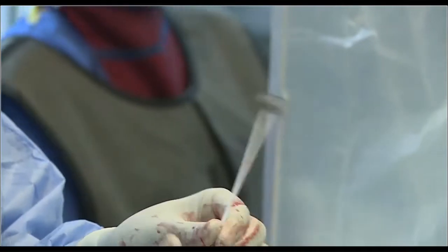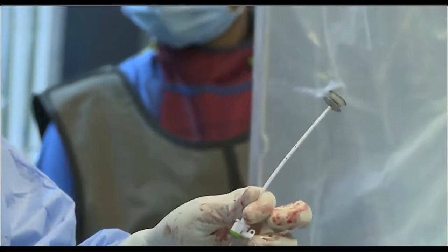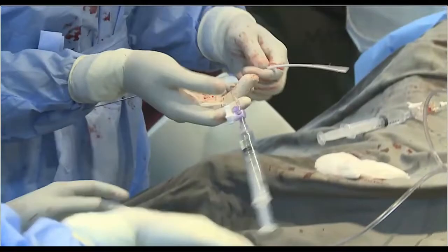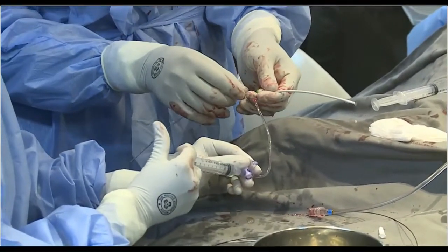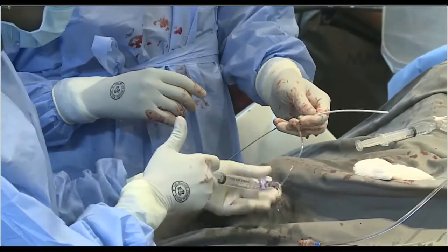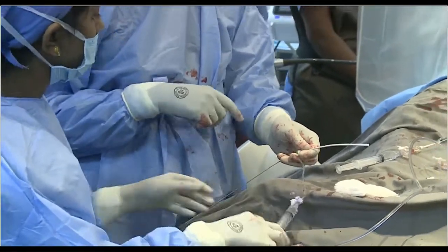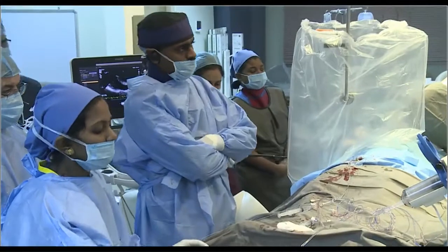It is compatible through a 6 French sheath. You can see that this is a 6 French loader, and now we are going to take this device, flush it. I have right now loaded a 14-12, but I can change over to a 12-10. What Damian and whoever has used a multifunction occluder, what is your view?